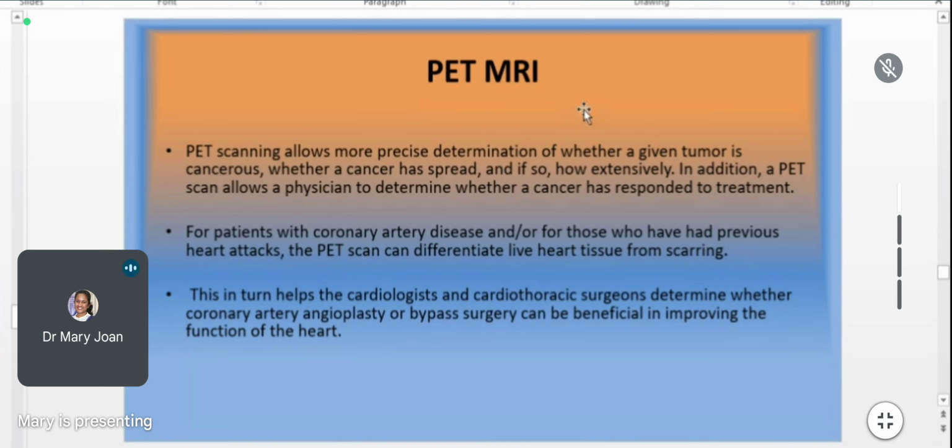So a combination of these two will help in identifying, locating, understanding the nature and characteristic of whatever type of abnormality is there in the body. Especially in cancer it matters because there may be a big mass as a tumor, but it may not be active, or it may not be fastly proliferating.